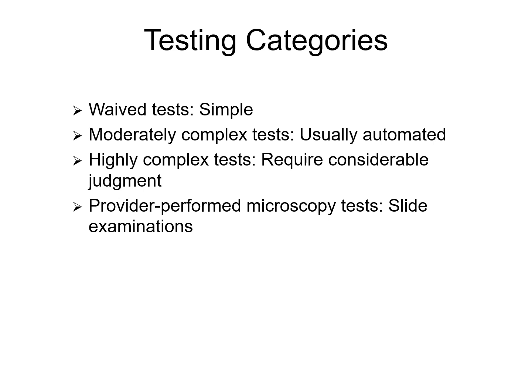And then we have provider performed microscopy, or PPM testing. The characteristic of this test is that it involves direct slide examination by the healthcare provider.